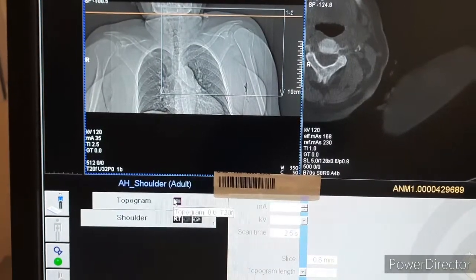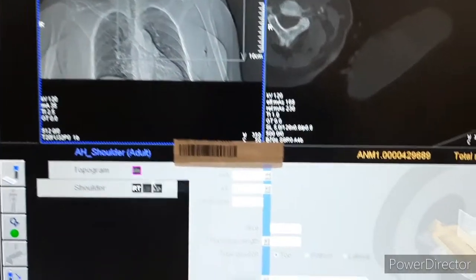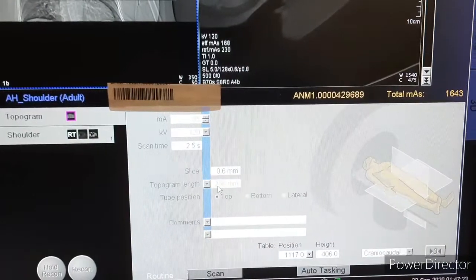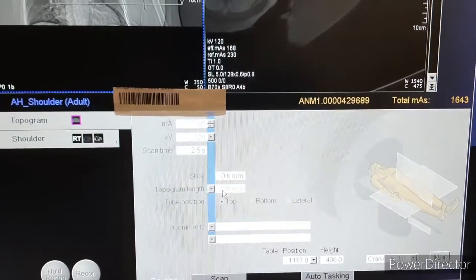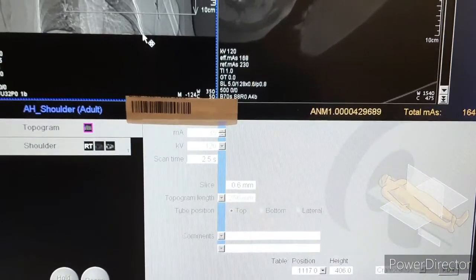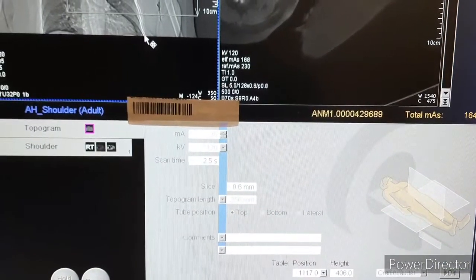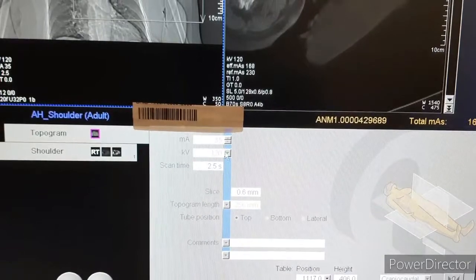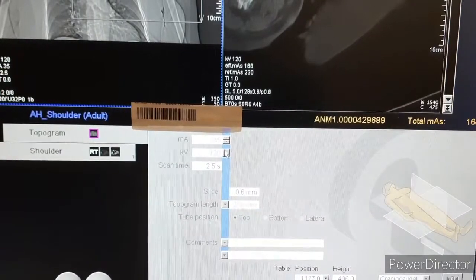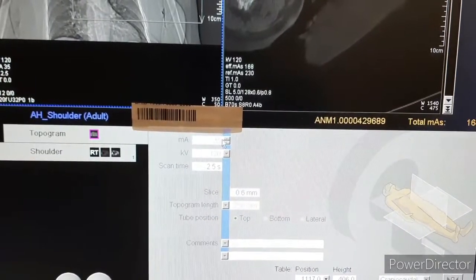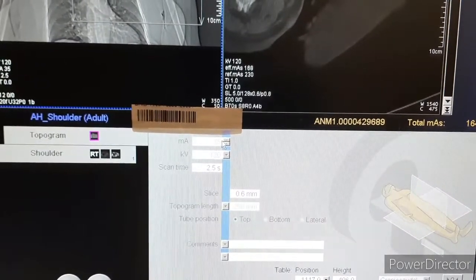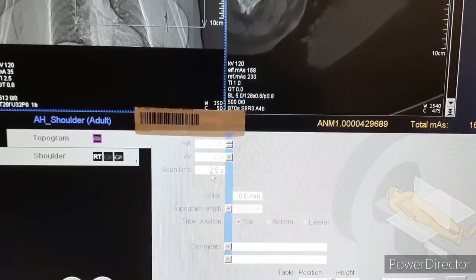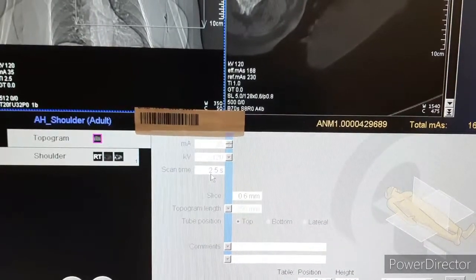First, we have to take a topogram with a length of 256 millimeters. The kV used is 120 and mA is 35. Scan time is 2.5 seconds.